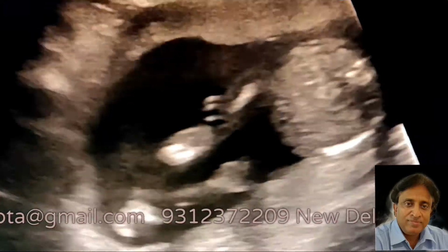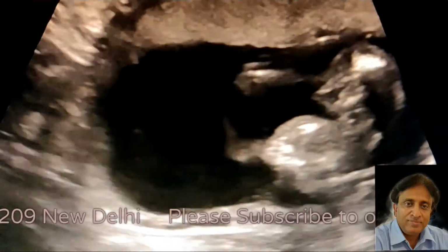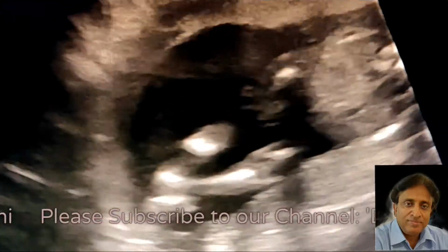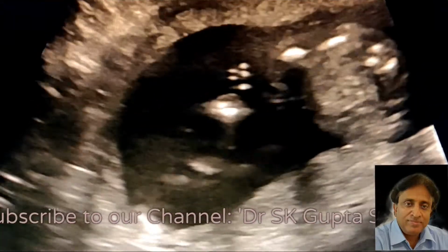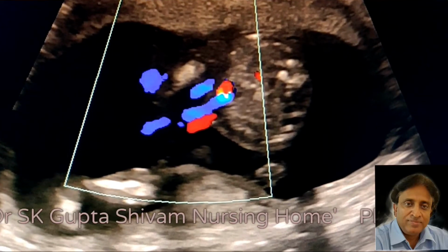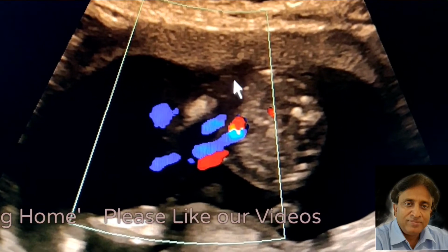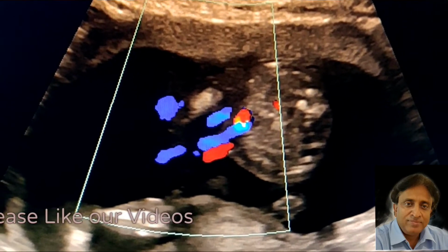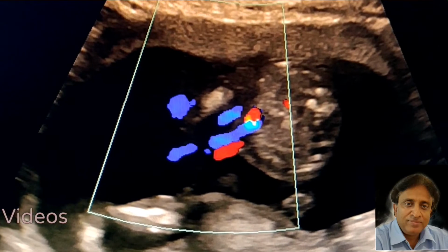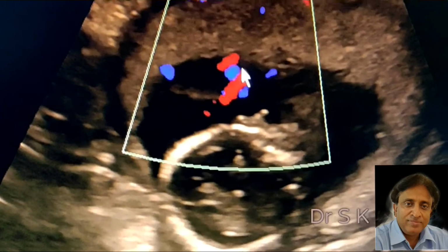This is the rest of the baby in quick motion, and you find that the skull and the upper lip and the lower limbs appear to be normal. The lower limbs are showing active fetal movement. The 3 vessel cord is normal, and the origin of the cord from the abdomen is also normal, and the cord is attached normally to the placenta, which appears to be normal.